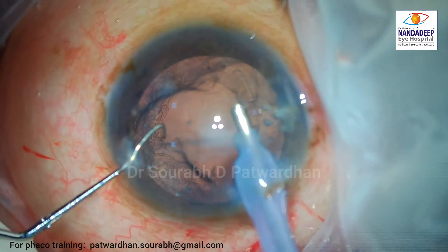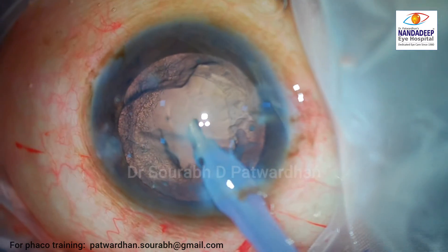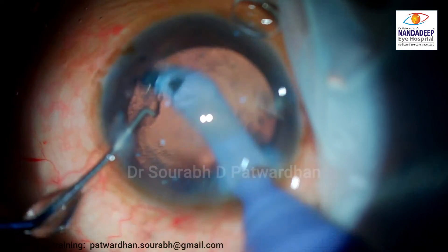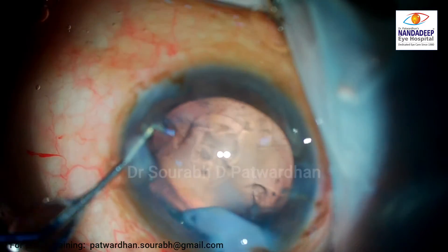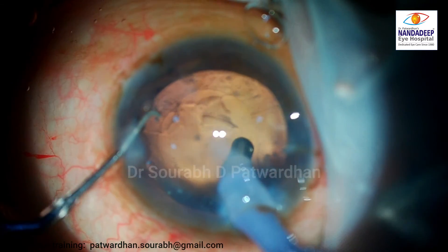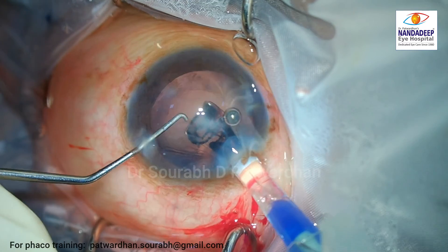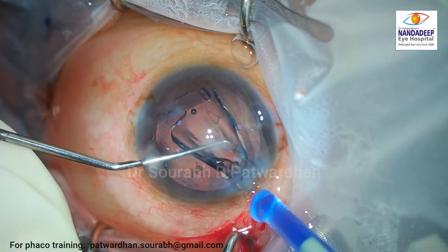As you can see, this patient also has some corneal opacity in the center. This is followed by cortex wash — there is hardly any cortex, but there will be some flimsy filaments, so it's better to just wash them off, followed by IOL insertion in the bag.